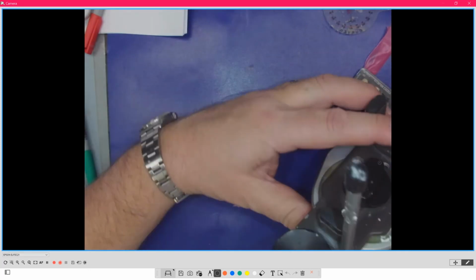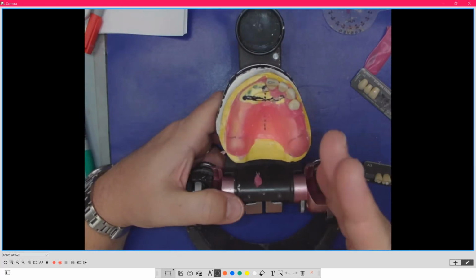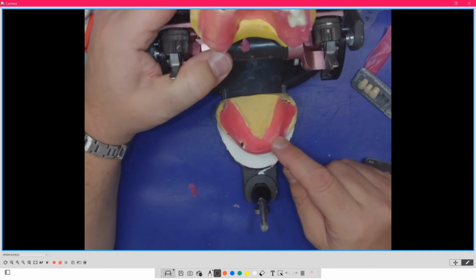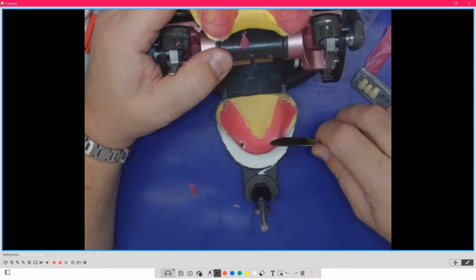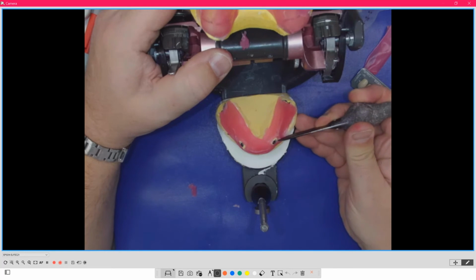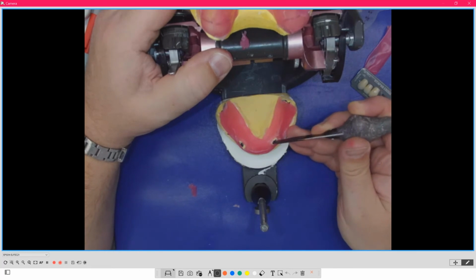So what the model analysis does is it helps us see where things should go from that golden proportion rule for that patient. And these black dots that you see down here, the black dot for me is, again, where the first premolar typically goes, and that's at the end of the buccal frenum. So wherever that buccal frenum lies is usually where the first premolar lies.